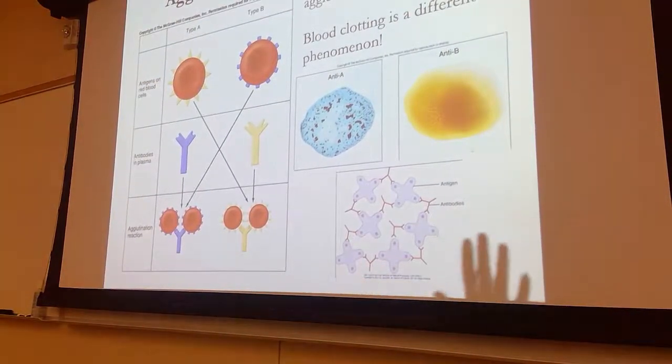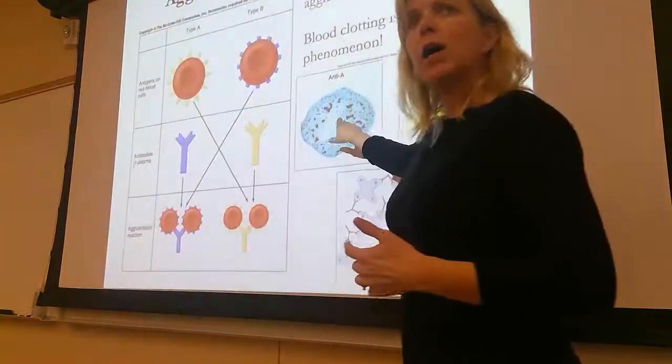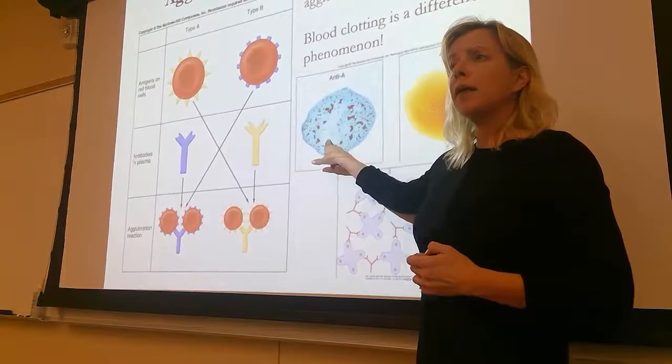I provided the blood with the antigen A. You added the anti-A antibody. They reacted with each other, and now my red blood cells precipitate out of solution. If you saw that clumping, that's what it's called, clumping, then you would say, Kara, you have blood type A.